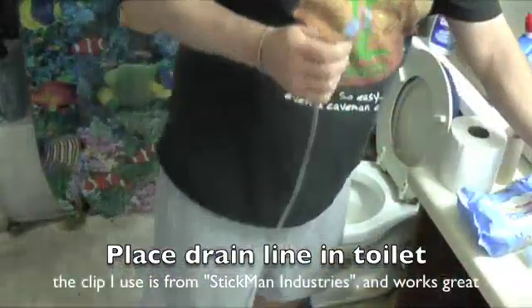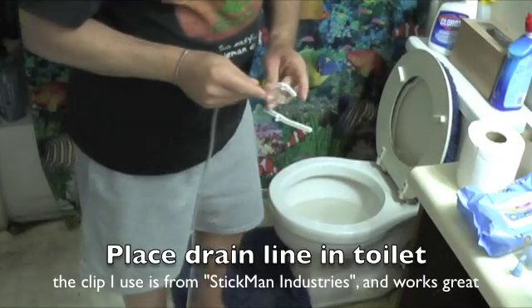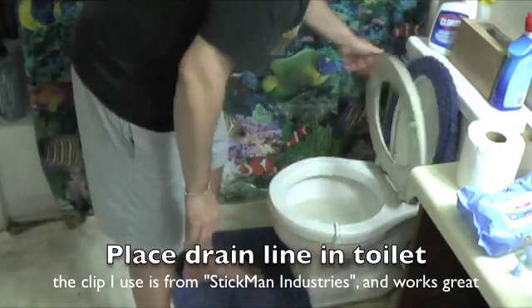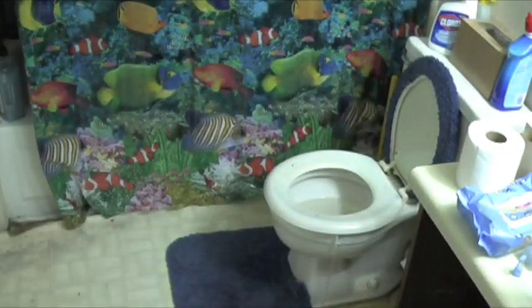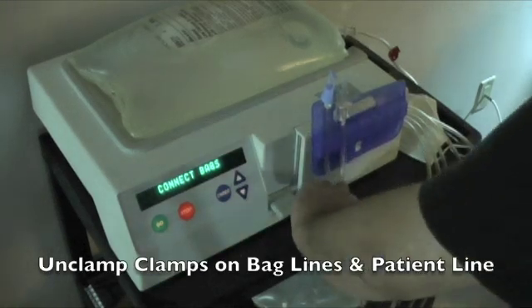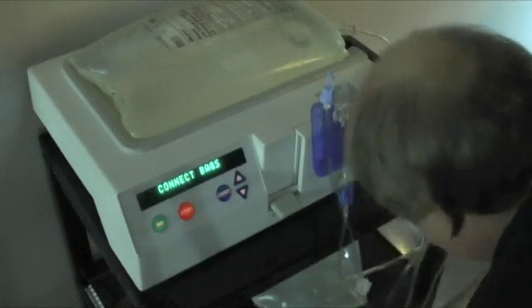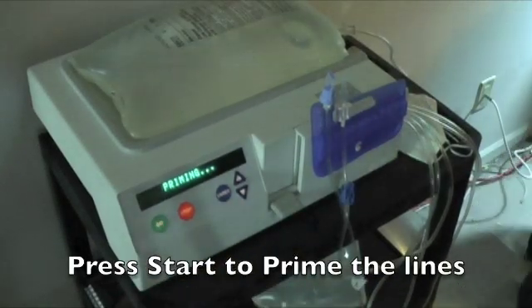Here I'm placing the drain line to my toilet — luckily my toilet is close enough to use the drain line. Some people have to use drain bags, but I'm able to use the drain line. I purchased a handy little clamp from Stickman Industries that clamps right onto the end of the toilet so you don't have to tape it. Then I unclamp all the clamps on the lines of the bags and the patient line, and press start to begin priming the lines with the dialysis fluid.